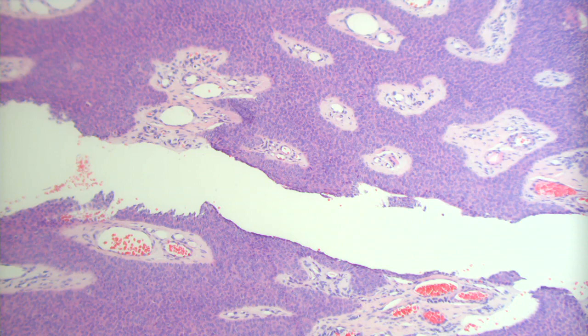differential includes the other poroid lesions. So we won't go through all of those this morning, but just so you know, they all kind of have the same cell type. So there's like 4 of them that you kind of have to know. Okay, very good.